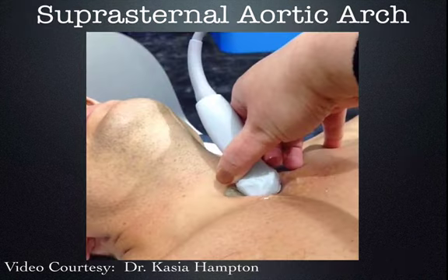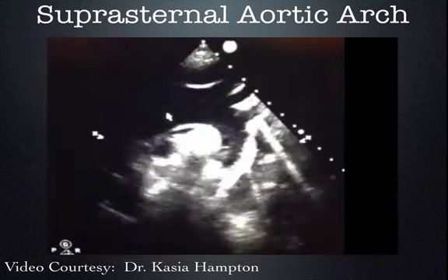Now, another way that you can evaluate the ascending aorta as well as the aortic arch is to try the suprasternal aortic arch view. And this video and image was supplied courtesy of Dr. Hampton. You can see here we've taken the cardiac probe or phased array probe. It's been placed in the jugular notch with the probe indicator pointing away from your point of view to the patient's left scapula. The back side of the probe is fanned towards the patient's chin, and you should see the aortic arch as seen here.